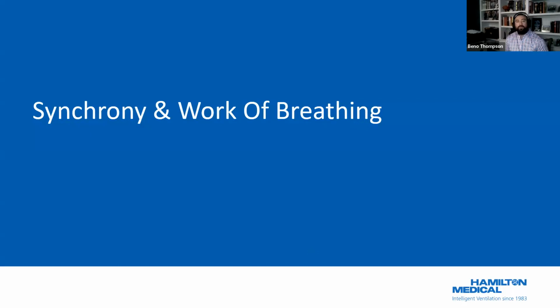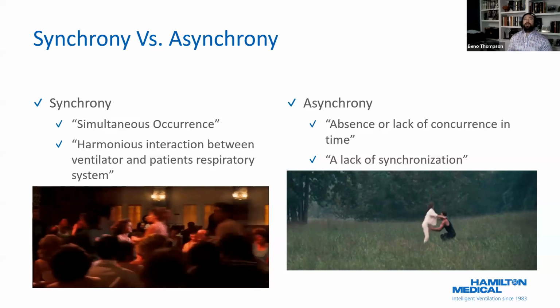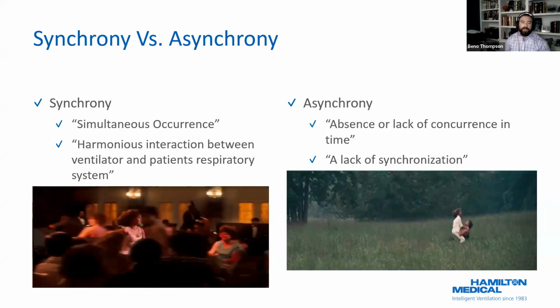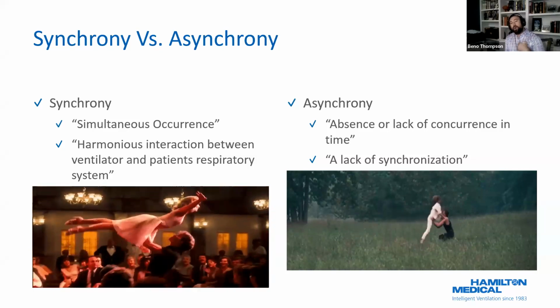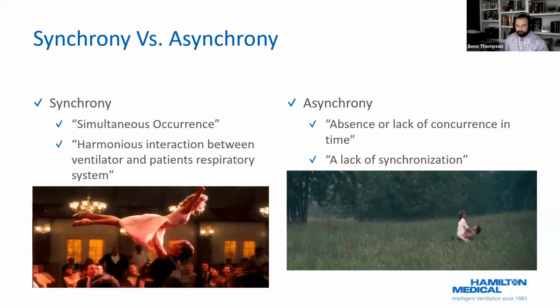First, we're going to talk about synchrony and work of breathing. Can't really talk about synchrony and asynchrony unless we're all on the same page on what they are. Synchrony is defined as a simultaneous occurrence between two entities, or a harmonious interaction between two entities.